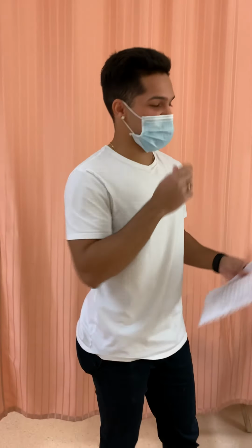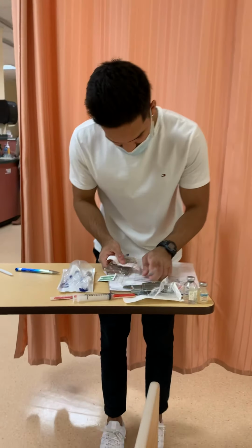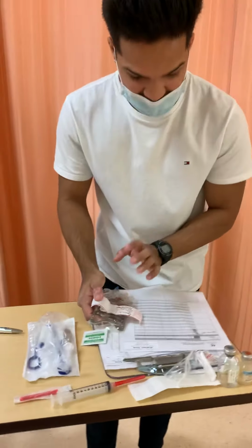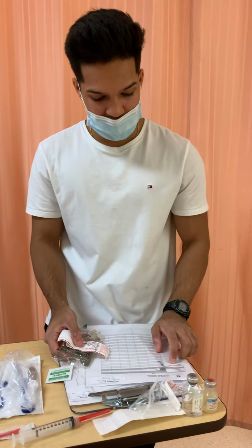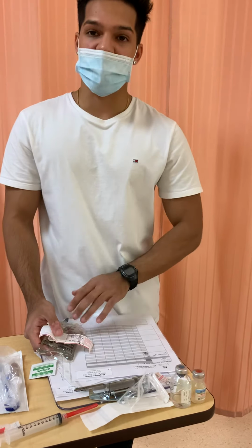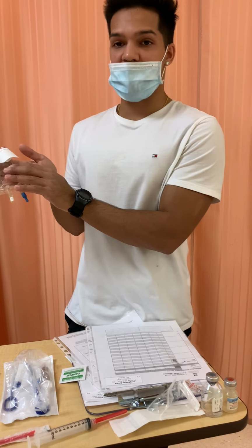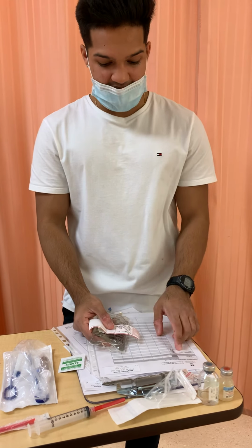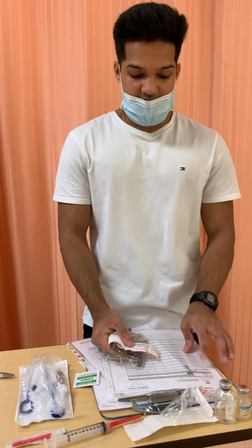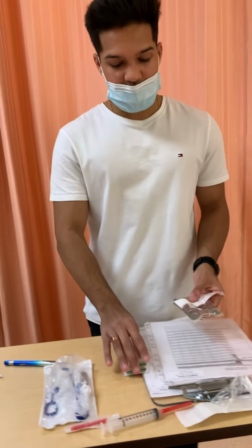I'm going to be doing my third check by the bedside. Okay. This is for Ricinema. The medication we're giving is cloxacillin, and I did dilute cloxacillin here. Dose we're giving is 1 gram, and that was 4 mLs of medication, and I diluted 4 mLs of medication in a 100 mL bag of normal saline. Therefore, I have a total of 104 mLs in this bag, and the route is IV. This is an IV mini bag, and the time frequency of medication is every 6 hours. Not given, signed off for on October 20th at 0600, so I will be giving it.